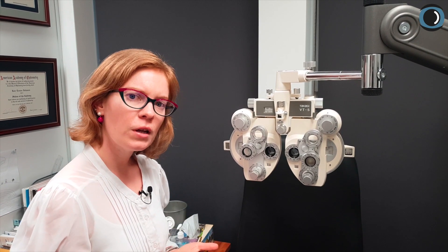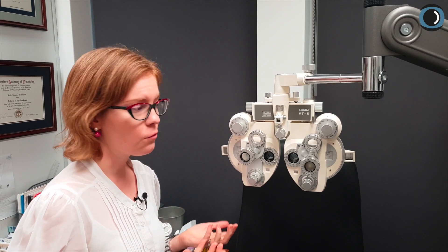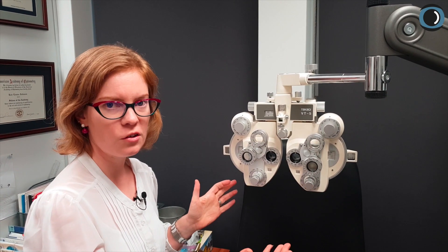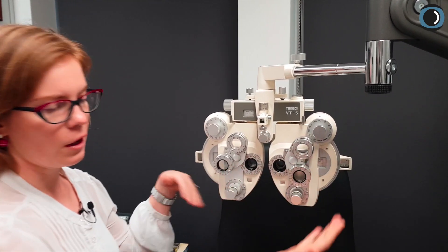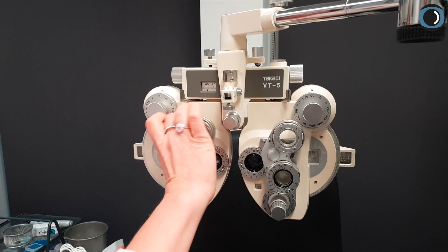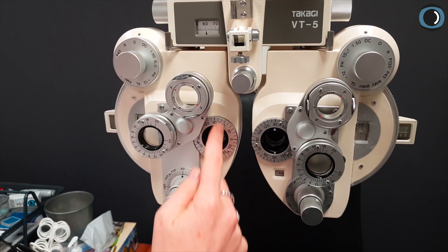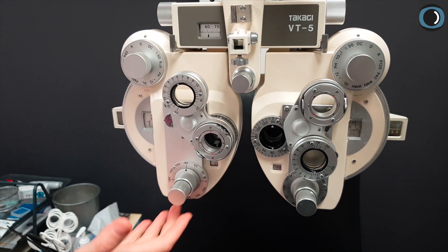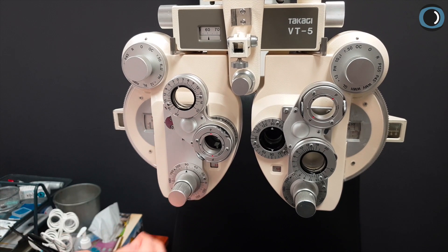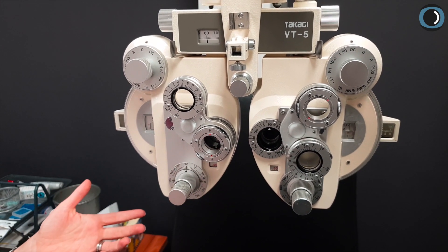Say you've done your retinoscopy already, or you have a previous refraction you're starting from. I've just set up a bit of a dummy refraction here. We're going to check the refraction in our invisible patient's right eye. Say my previous refraction is minus 025 by 90. I'm going to firstly check this patient's power and give them a difference to see, so I'm going to put it up to minus 050 straight away, even if I think the answer is 025.